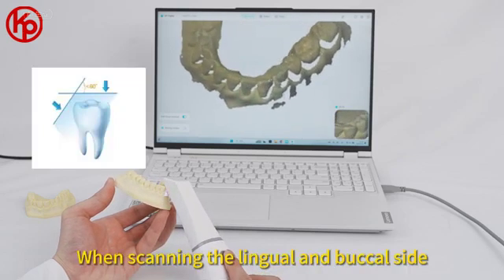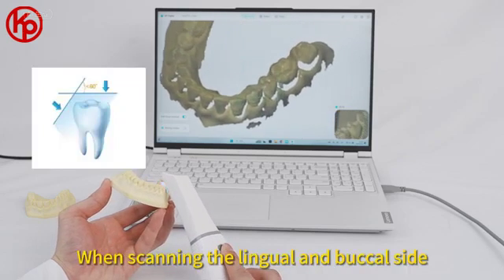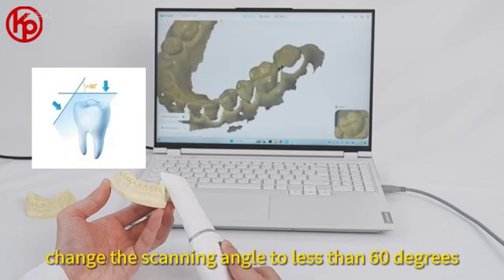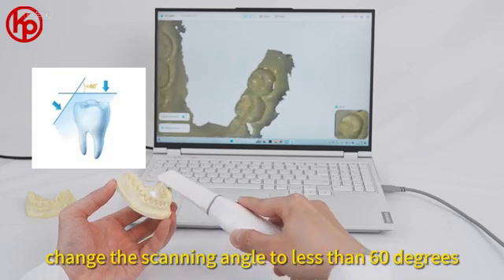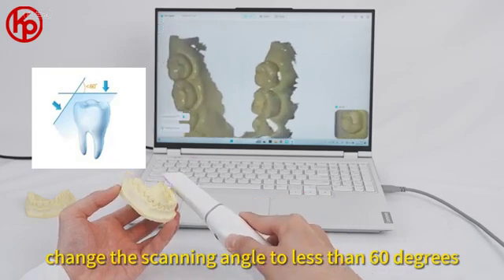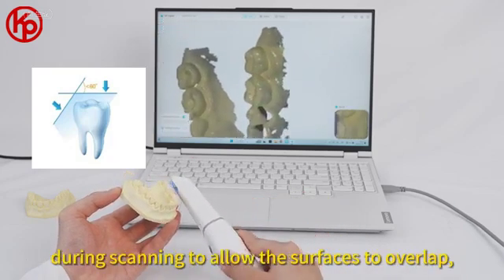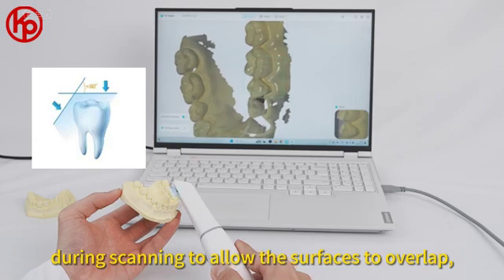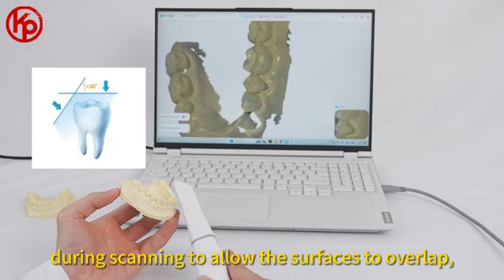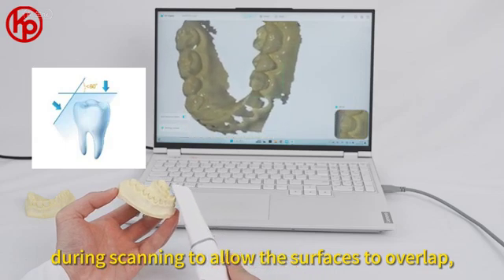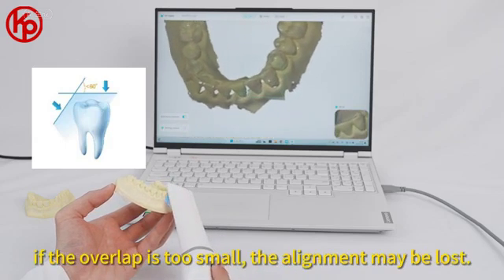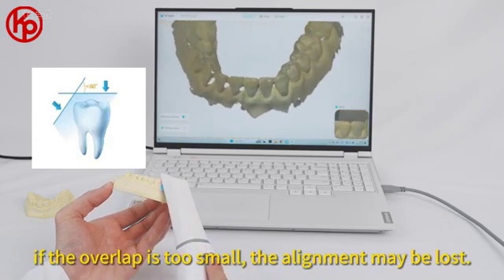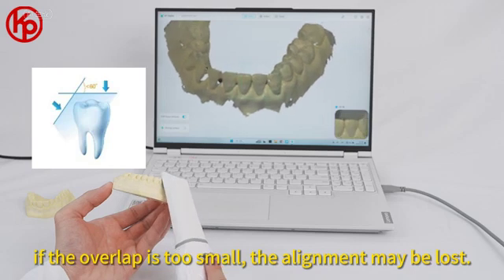When scanning the lingual and buccal side, change the scanning angle to less than 60 degrees during scanning to allow the surfaces to overlap. If the overlap is too small, the alignment may be lost.